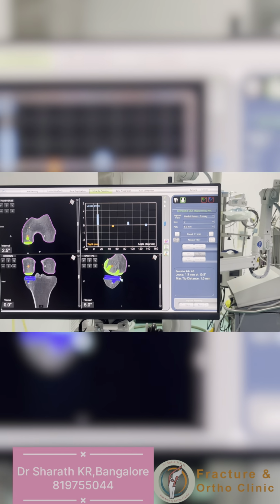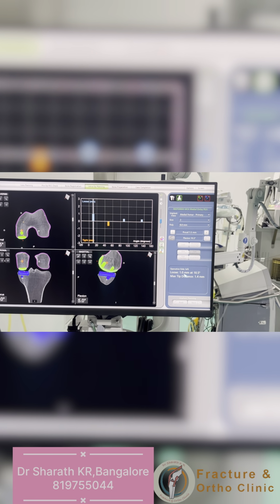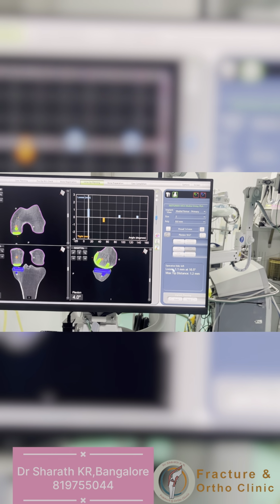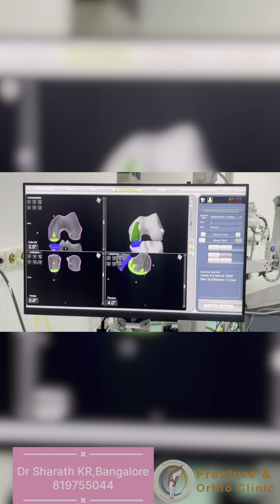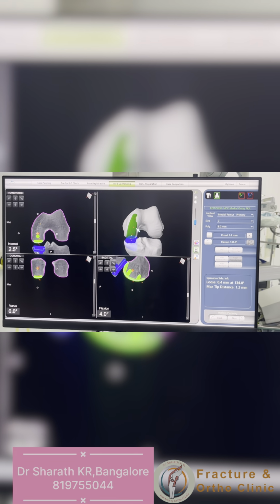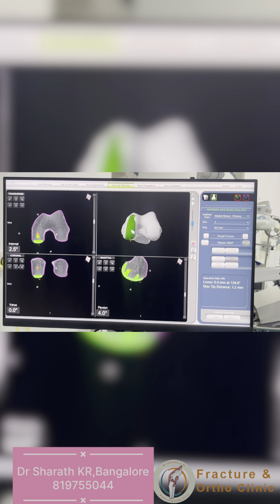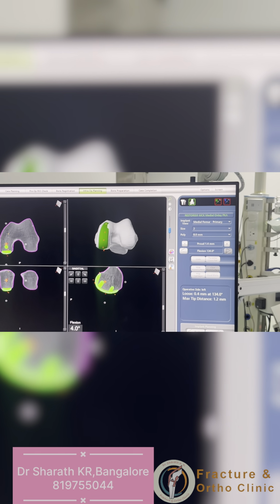The space opening of the knee should be taken in multiple flexion ranges of movement. And then consolidated values of each gap in flexion and extension are shown in this graph. For example, in this graph, it is showing at extension how much is loose medially, and in the flexion 45 degree, 90 degree, 120 degree, how much is loose. Like that, values are shown in the graph.